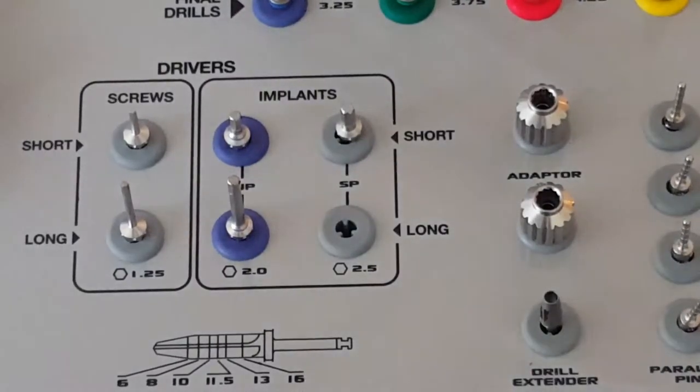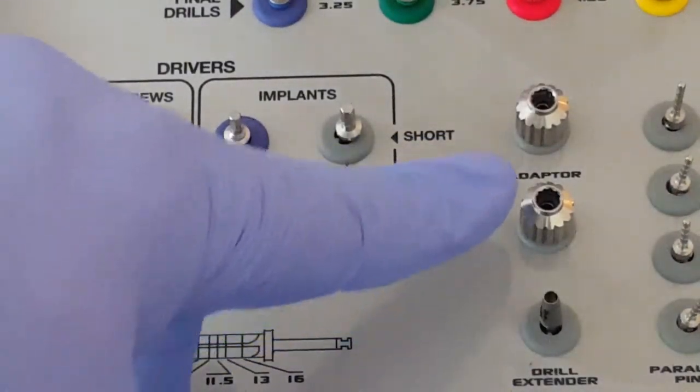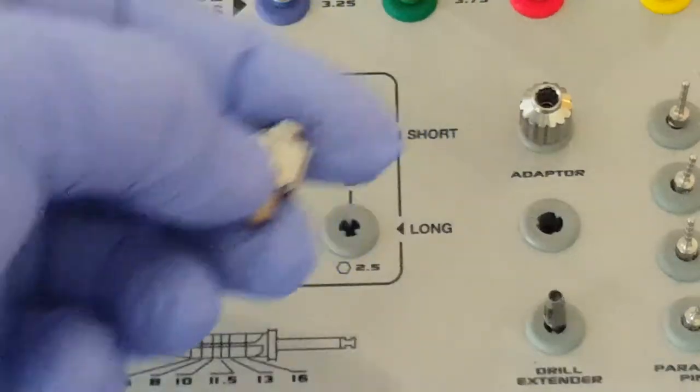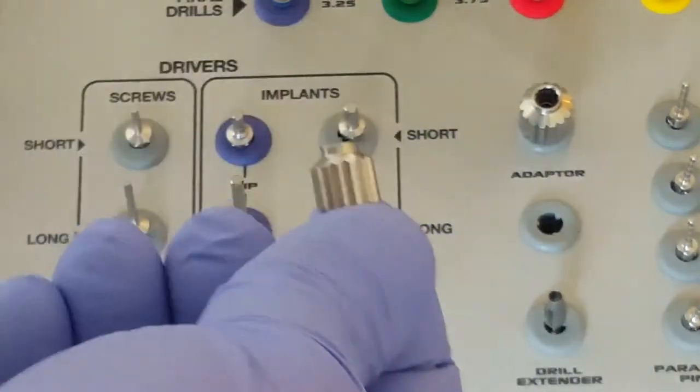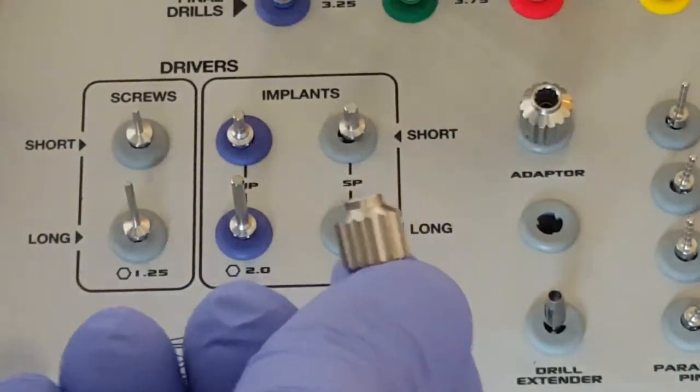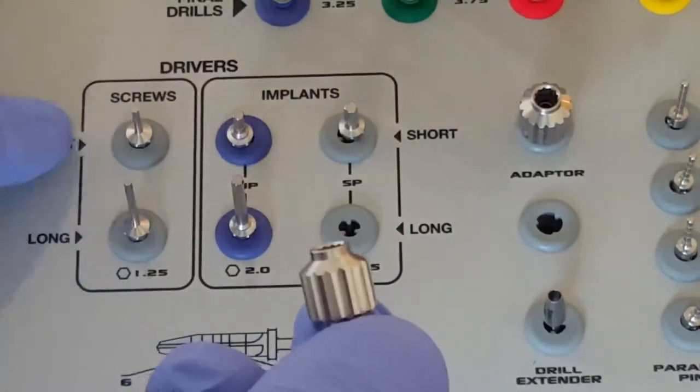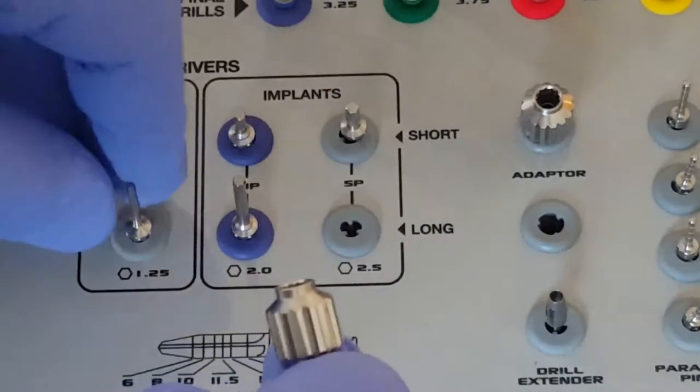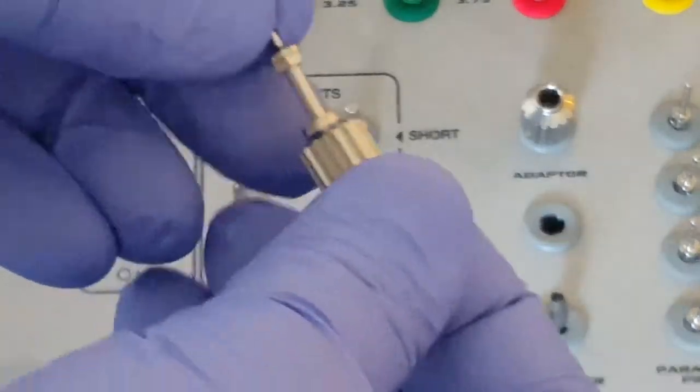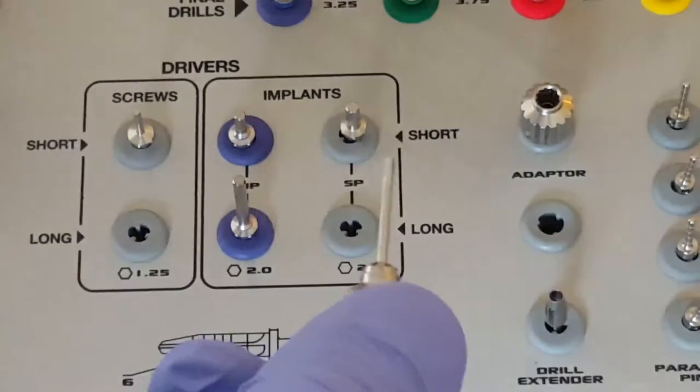When we need a screwdriver, we can take the adapter, and if it's going to be a long screwdriver, we select the long hex key, or short screwdriver, the short hex key. So we remove it and insert it into the adapter, and we've created a screwdriver.